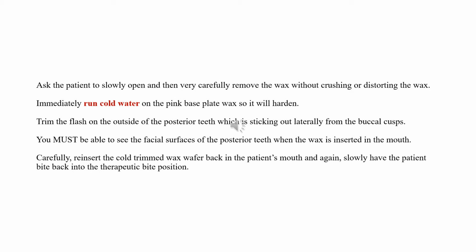Be very careful. Bring it to the sink and immediately run cold water on the pink base plate wax so that it will harden. And it will harden when it gets to room temperature. It becomes real hard. Now, one of the things you have to do is see when you put the wax on the master models, you need to be able to see the teeth, right? So you've got to know that the teeth fit into the wax. I don't know how to emphasize this. I want you to memorize this. The teeth of the models must fit precisely into the wax indentations made when you take the bite.